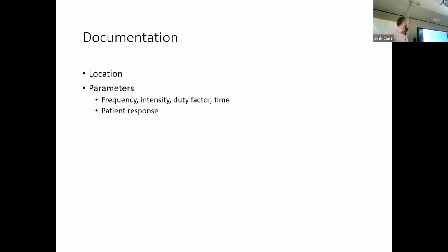All right, to document, we want to document the location, not location of your clinic, but location on the patient's body. What did I do this to? And then document your parameters. What was my frequency, intensity, duty factor? How much time did it take?